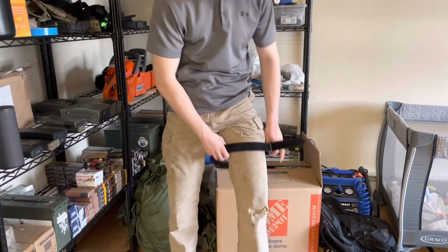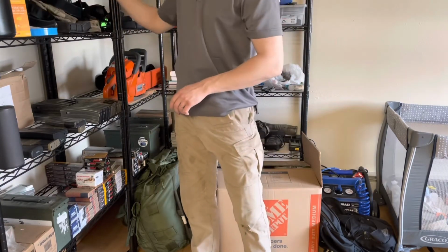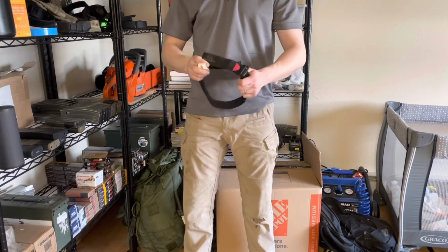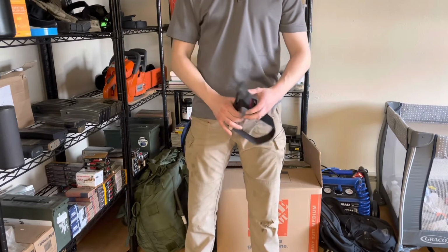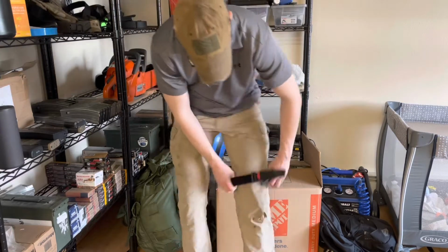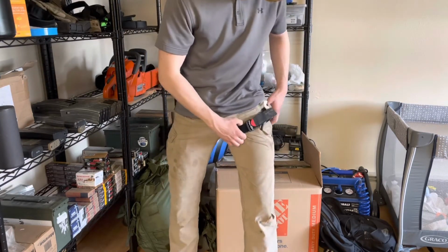We'll go ahead and do it full on with the earlier generation CAT. Like I said, you don't want to use your carry tourniquet for legit application because you don't want to overstress your windlass before you actually need the tourniquet. So that being said, we're going to go ahead and put the tourniquet on. And we will be doing a full-on occlusion on this one.